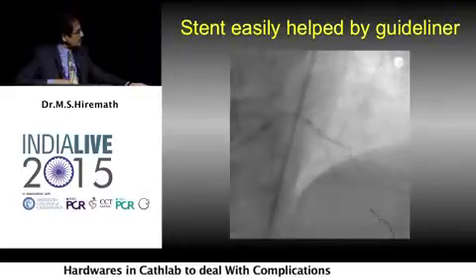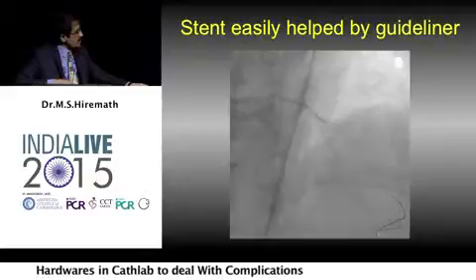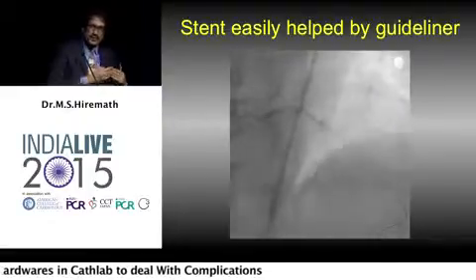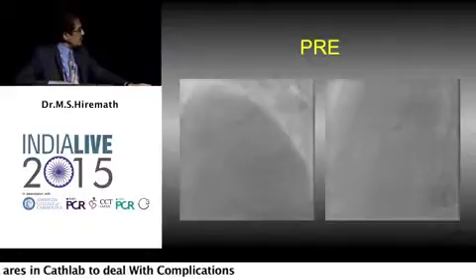And you can see the GuideLiner lying here and the stent tracking down very easily through the GuideLiner. So whatever you take, the GuideLiner must have a balloon or a stent ahead of it before you go there.